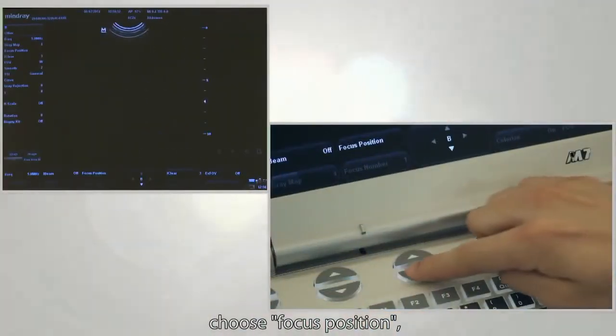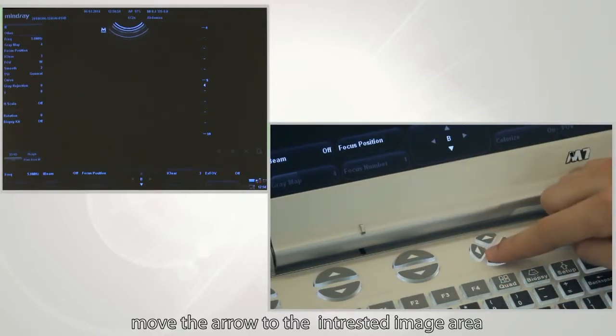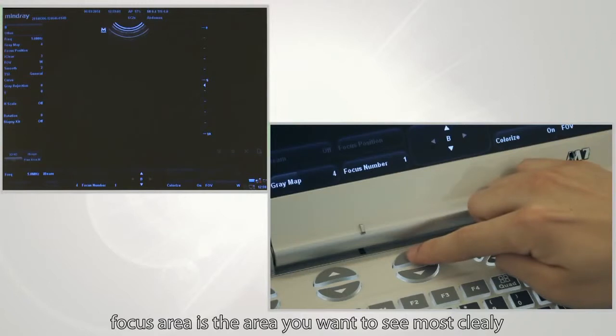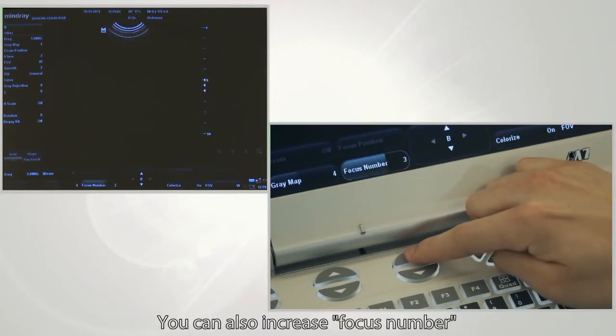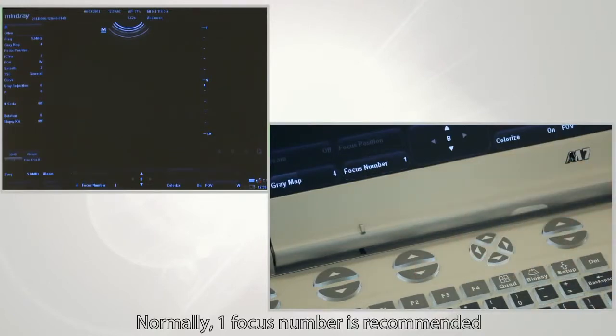Next, adjust the focus. Choose the focus position and move the focus arrow to the desired area of observation. The focus area is the area you want to see most clearly. Select the number of focus areas and their positions — usually one focus area is recommended.